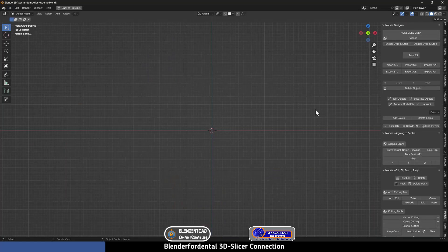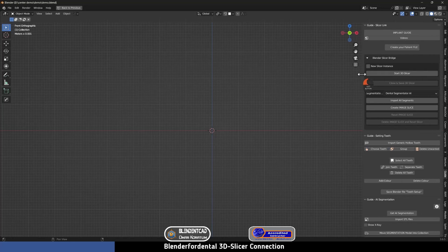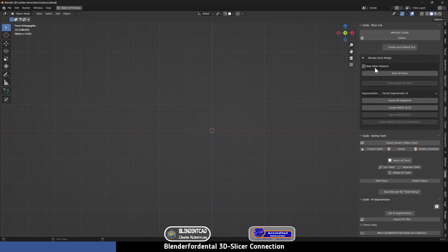Now I have started a new project. I'm going to the Guide Designer, and when you create your patient file — which is a folder that will contain all the files you are going to work with — I'm going to enable New Slicer Instance and then click on Start 3D Slicer.